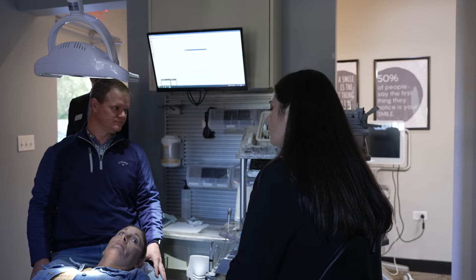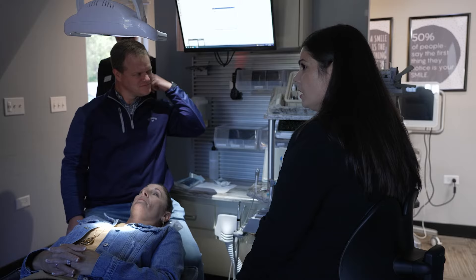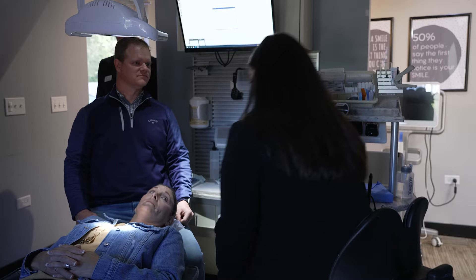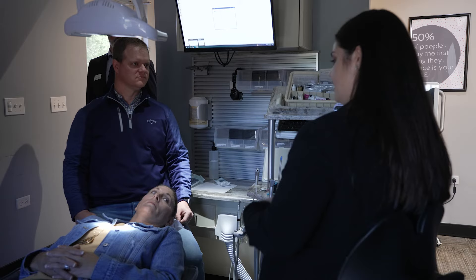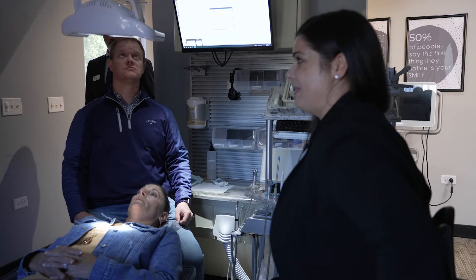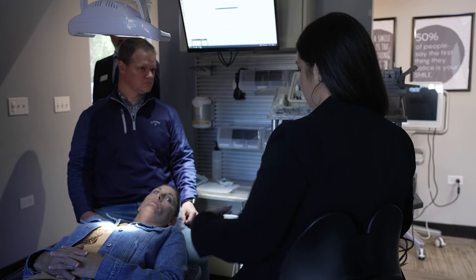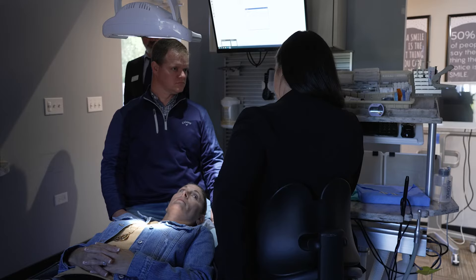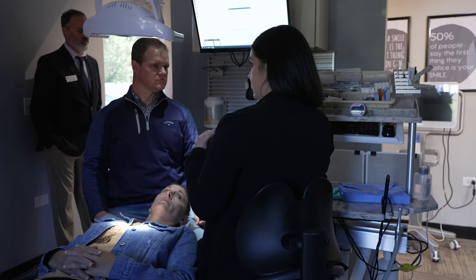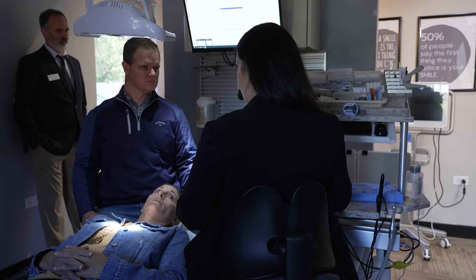You're on the hygiene side — have you done assisting? What was the big thing for you assisting with that belly bar? Keep leaning over. That's right. Do you know why you had to lean? You're so far away. The other problem is, if you ever paid attention to your posture in one of those chairs, it's like this. Dentistry is bad enough on our backs as it is, so we don't need to give it more room for damage. And number three, you need two hands, not just one. Once this is correct, you can get rid of that belly bar to get in closer. Now you have the waterfall to engage your core and keep your back straight. The most ergonomic for the assistant is the interleg lock like this. If that's not comfortable, you can also do the side saddle where your knee would be here.